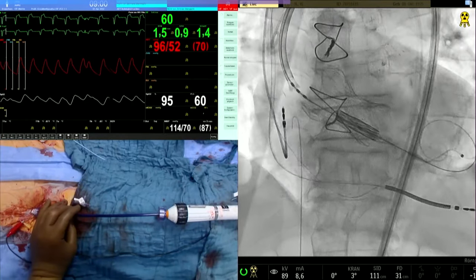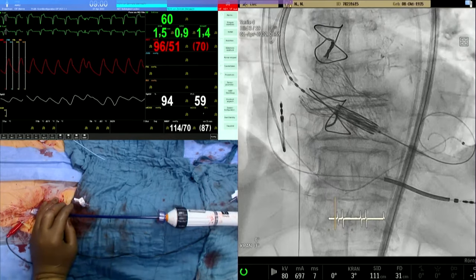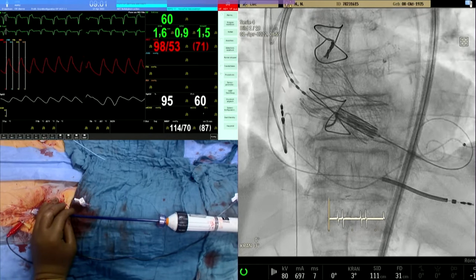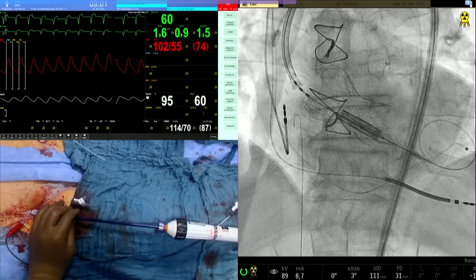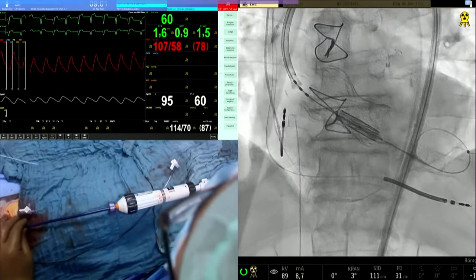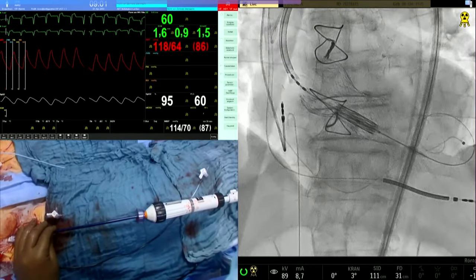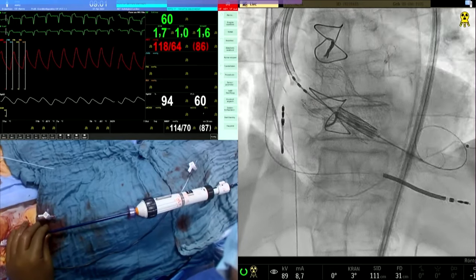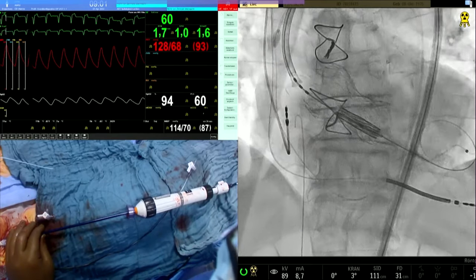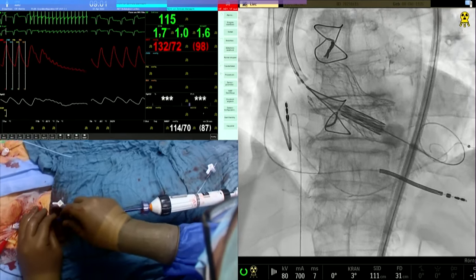Agreed? Yeah. Put the thing back on. So we don't need an angiogram. We can just proceed, I think. You agree? Yes. Okay. So of course it can move during implantation, upwards and downwards. Probably it will move a little bit downwards. Pressure is good. Yes. So let's start implanting. We would now pace, please. Don't be alarmed. Okay. Balloon up.